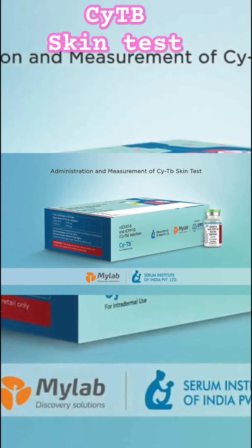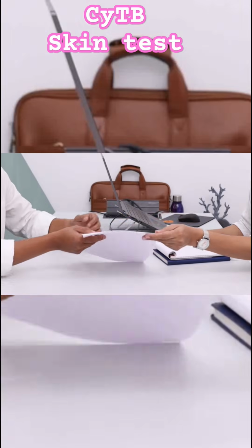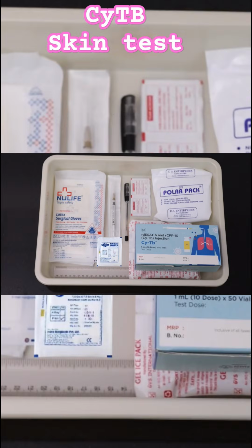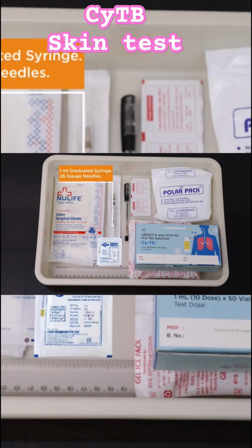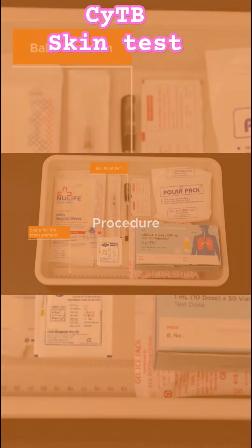We will be demonstrating administration and measurement of CyTB skin test. Explain the procedure and take the required consent. Materials needed for the procedure are a 10-dose vial of CyTB, sterile gloves, alcohol pads or spirit, 1 ml graduated disposable syringe, 26 gauge needle or suitable needle for intradermal injection, sterile gauze, ballpoint pen, and a scale for measurement.